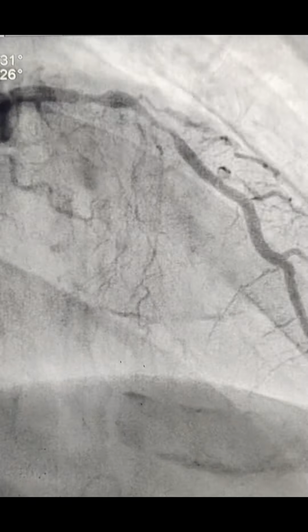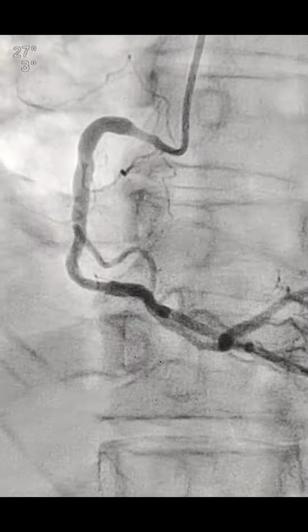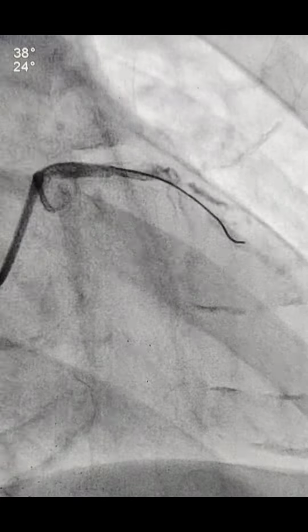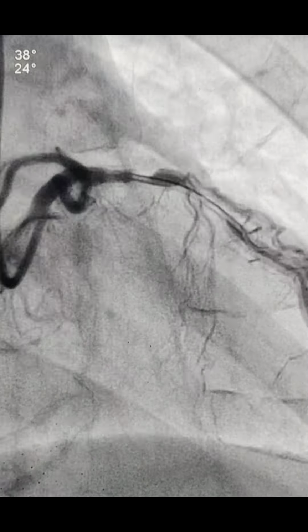And this is the RCA, and you can see the ostial RCA has a tight stenosis, 70 to 80% stenosis. So we decided to do the angioplasty to LAD and RCA because we had only 2 stent clearance in this insurance.